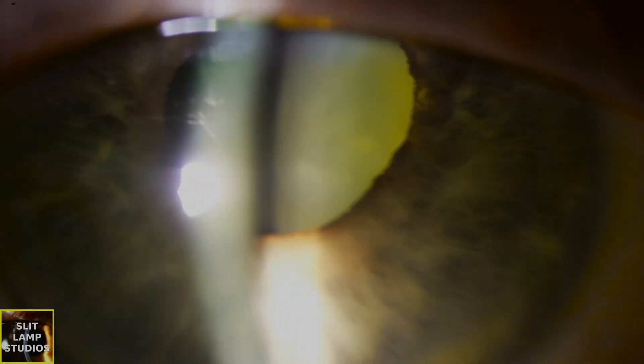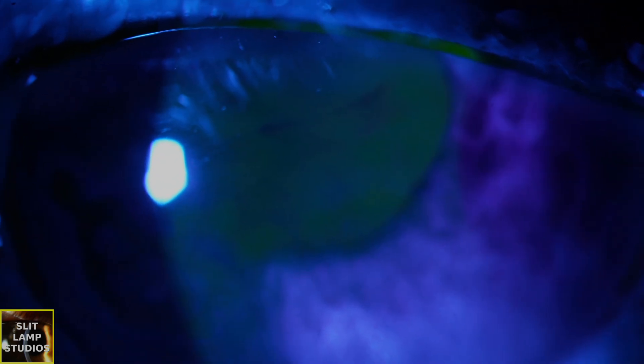Now putting in some fluorescein, we don't expect to see any epithelial involvement in disciform keratitis. Yes, there is perhaps a slightly reduced tear film breakup time, but not much else.